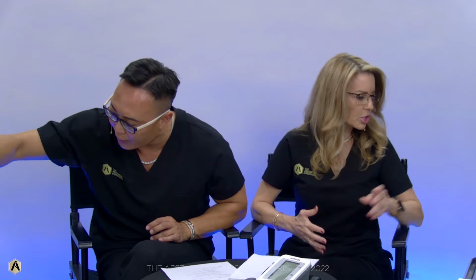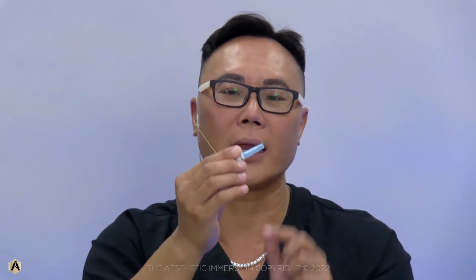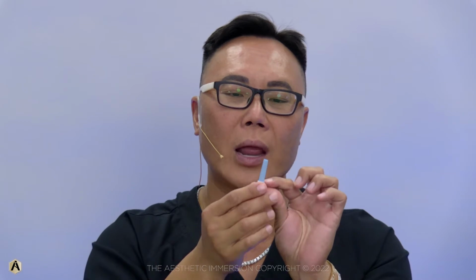Do they have the other needle? Did they give us the other needle? The other one that's a no waste one? I actually really do love that one. Oh, the no dead space. Yes. I don't know if they give it to us. And while you're back in the storage, you guys. There's one that looks like this, but it's a no dead space needle. It's 33 gauge, and it's super tiny. But what they did is they created it so they did not waste any. Let me see. Here. Do I have any?